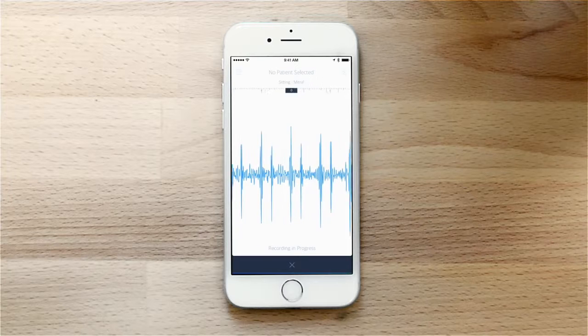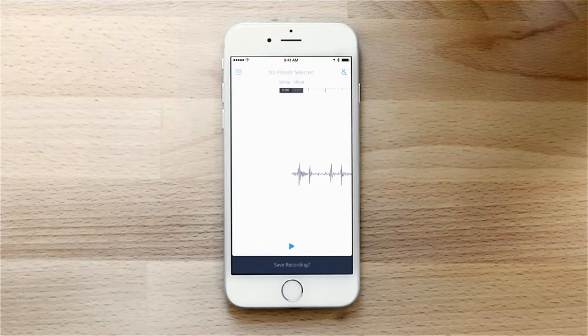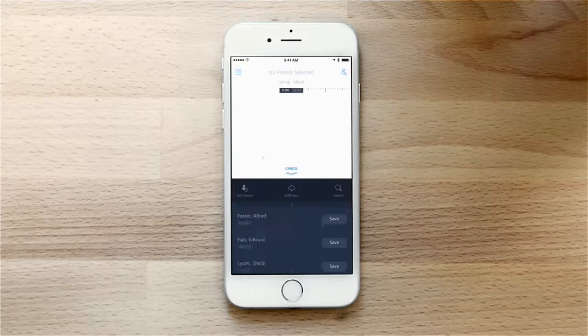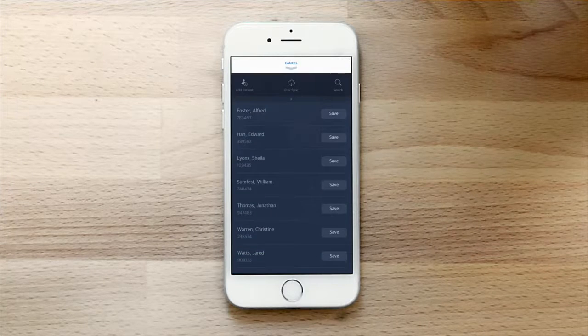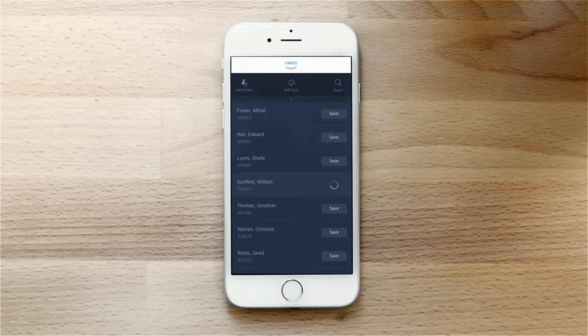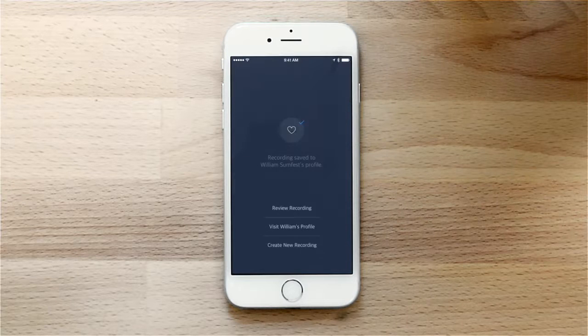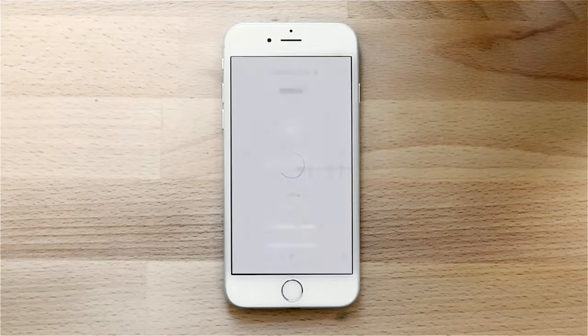To save the recording, you can sync with your EHR or simply add to a patient. Our sample sound is from Will Sumfist. You can play back your recording through earphones or a stethoscope.